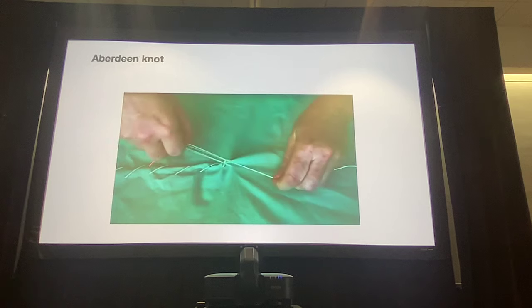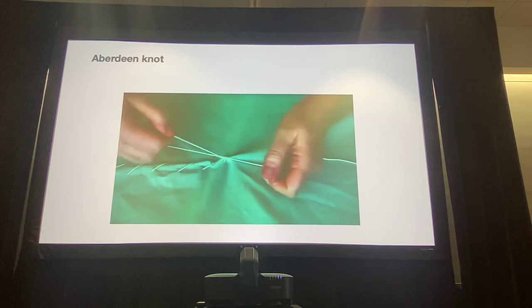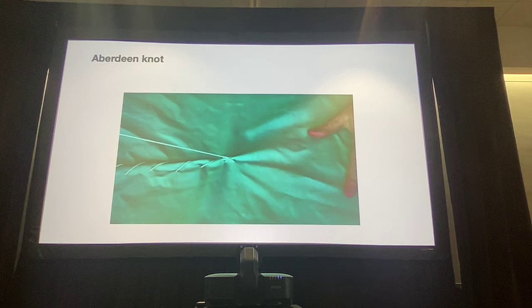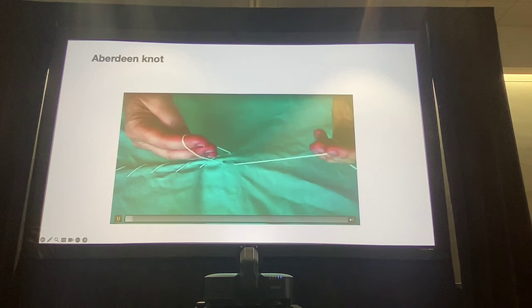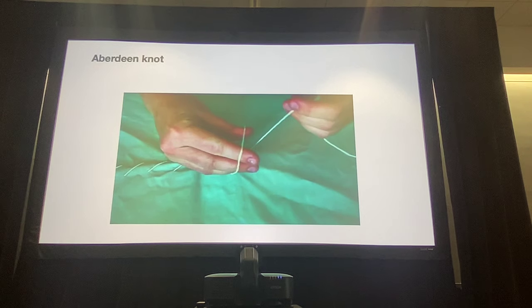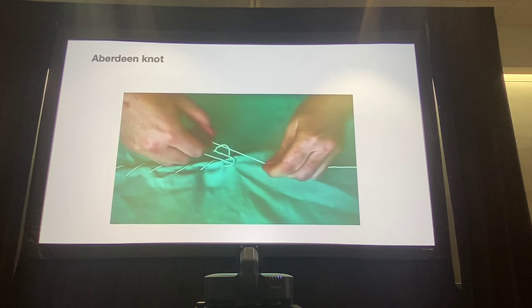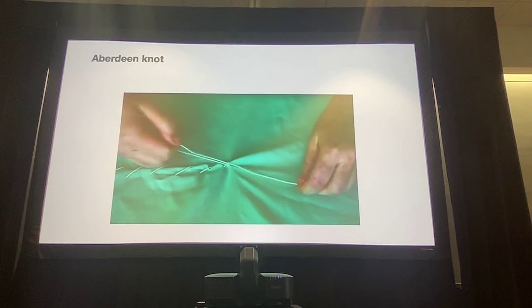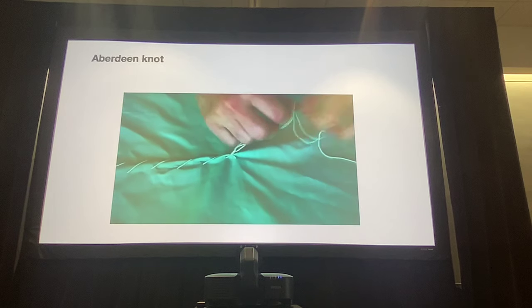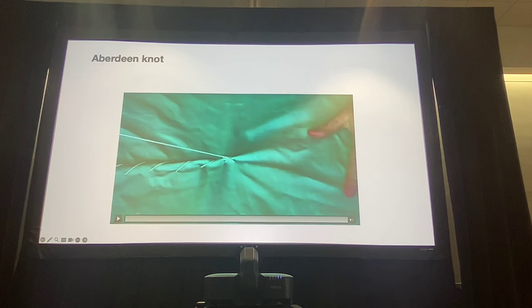You can see that this person already started a simple continuous pattern, and they're ending it here with this. So maybe on your prosthetic, first start a simple continuous pattern, and then try this knot out. Notice how this person is anchoring down that suture. That's what gives you that tension. What I've seen happen is when you try to create that loop, you end up losing it because that one area is not held down with tension. I'll show you again.